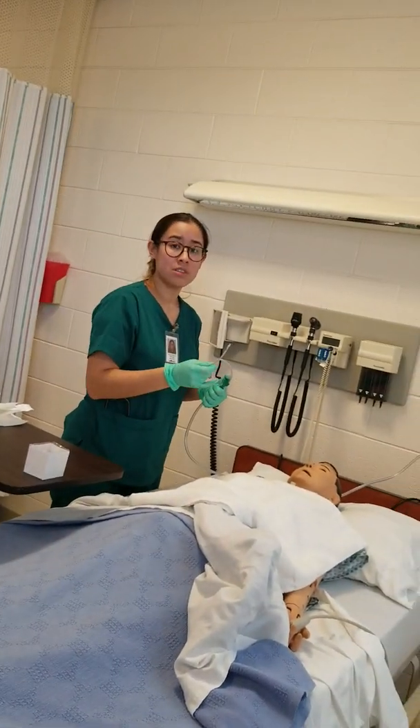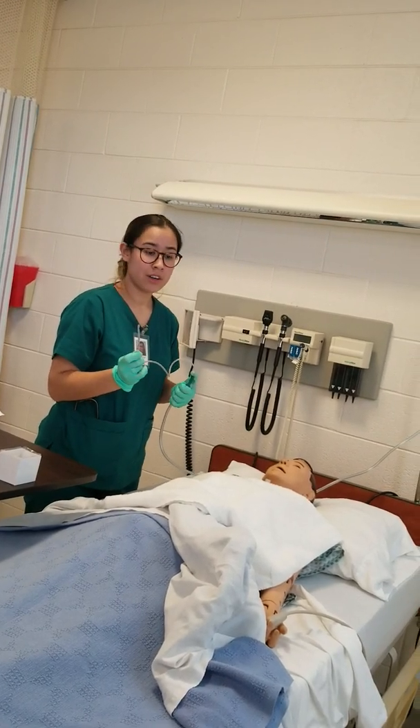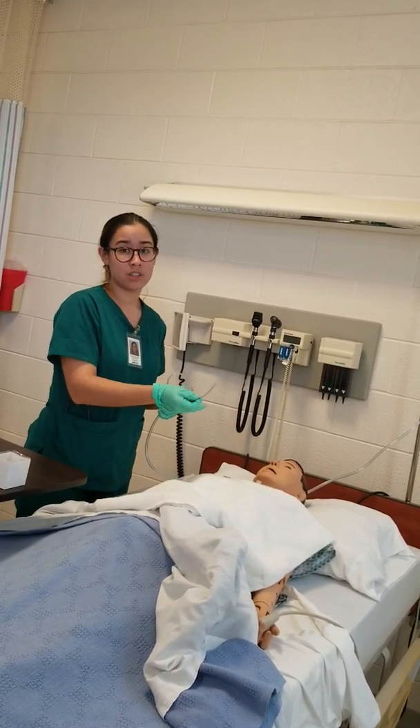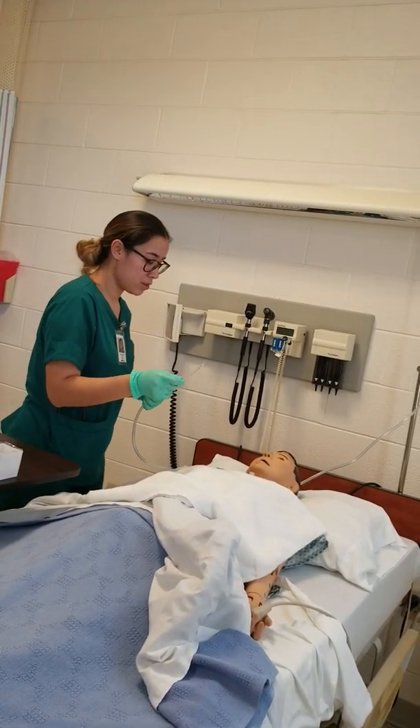I will listen to the lungs and see if they're clear already. If they are, I will stop. If they're not clear, then I will go ahead and suction again. I'll give him some rest and make sure his oxygen goes back up. If not, I would oxygenate him again and do the whole procedure again.